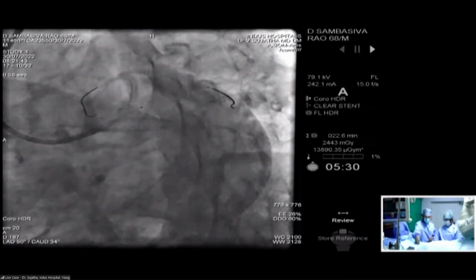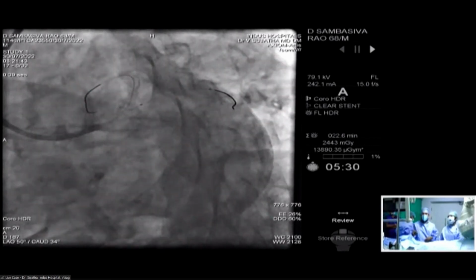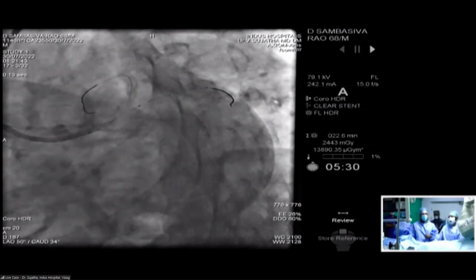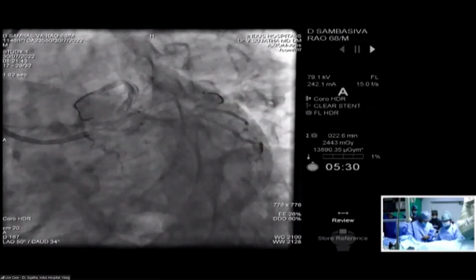So you want me to use 3.5 and then stent. Right. After taking care of the LAD, because the patient is having pain, I want to do the left main to the LAD first before I think about the OM3, though I can easily use a drug balloon in the OM3. Only the cost considerations are making me think. Yeah, that's the only reason I'm thinking. Yeah, that would be stent for me.